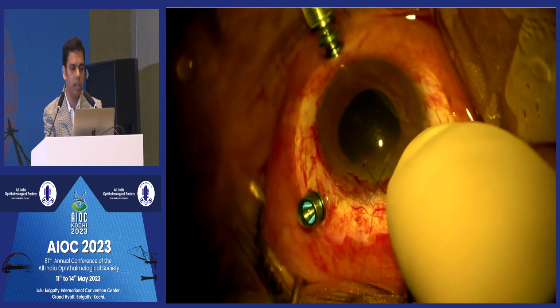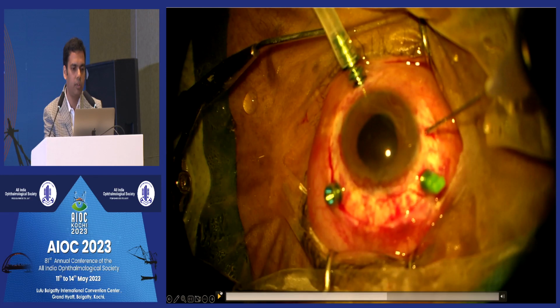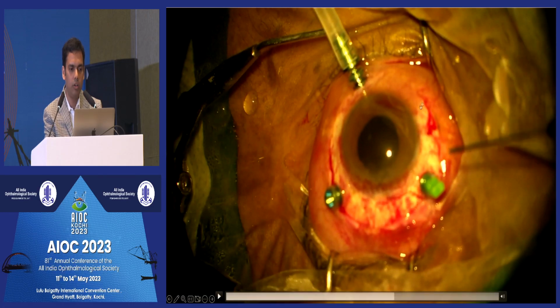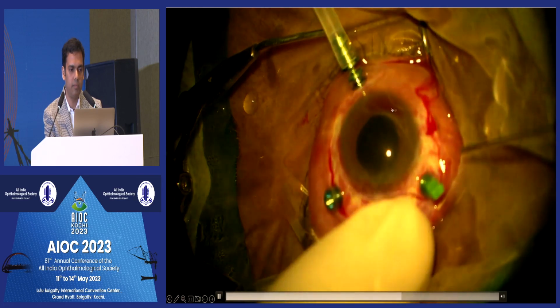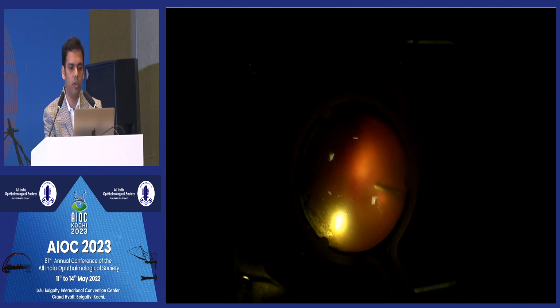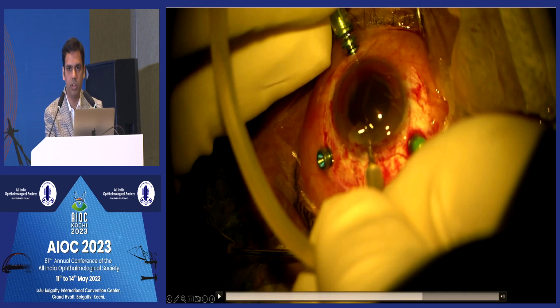This was sutured, and suddenly I noticed that superiorly this cannula was leaky, so probably the valve was not working. So I used some scleral plug, and then I made a port 1.5 mm from the limbus. I used a 25 gauge needle. I introduced a needle for SFIL, but probably the patient also had iridodialysis at this location, and there was also hyphema. You can note the presence of hyphema at this stage. And suddenly I felt there is hypotony and a loose globe. Immediately I checked and noticed that the infusion bottle had finished.